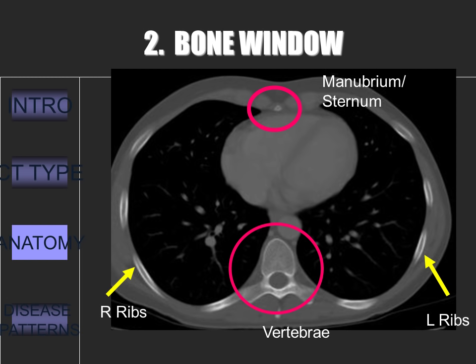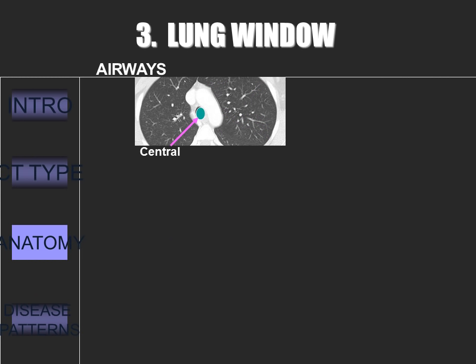Once you are done looking at the soft tissues, change to the bone window. In this view, the bony structures are emphasized. Scroll down and watch the vertebrae — look for fractures, lytic lesions, sclerosis. Next, scroll up and watch the sternum and the manubrium. Then scroll down looking at the right ribs, and then scroll up and look at the left ribs. You'll see fractures and lytic lesions, sclerosis, and other things if you follow this approach every time.